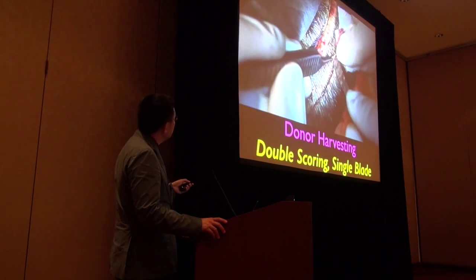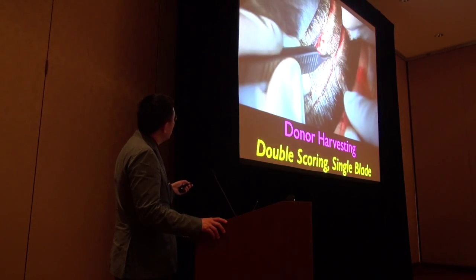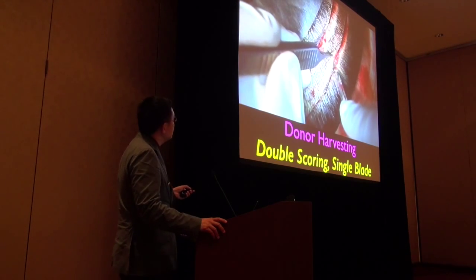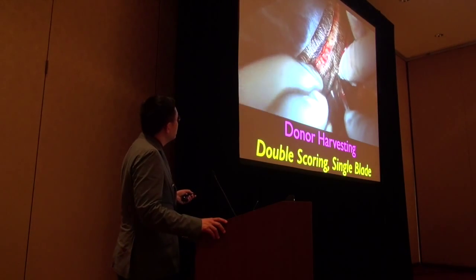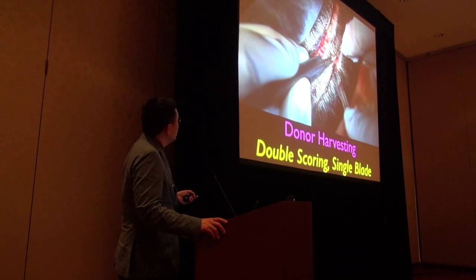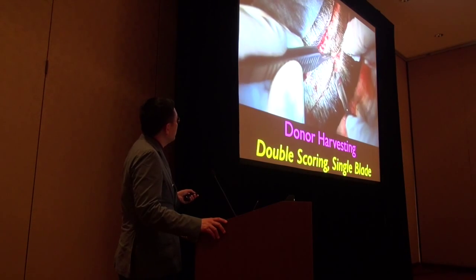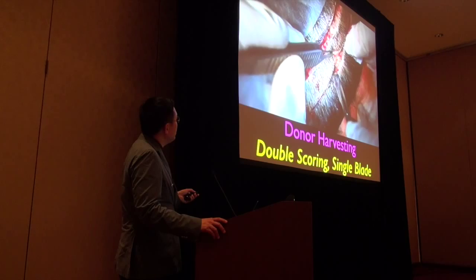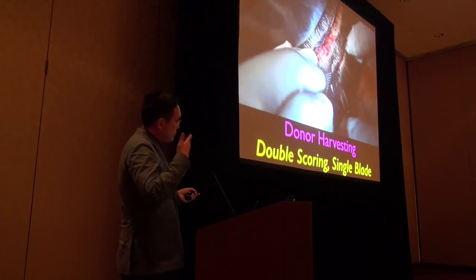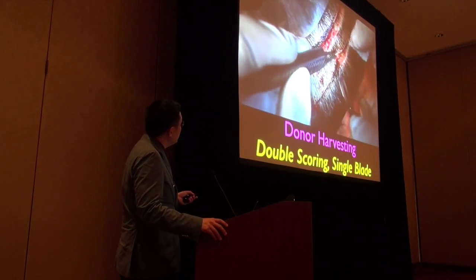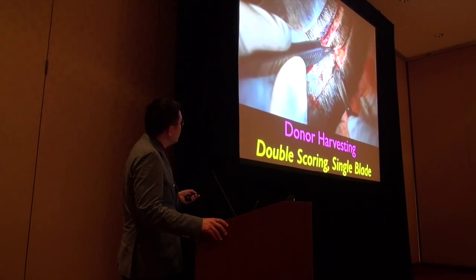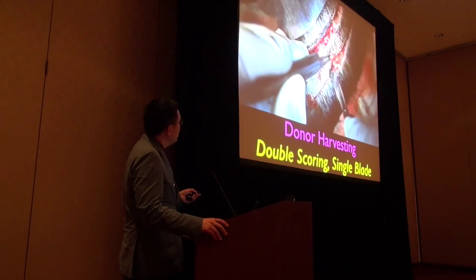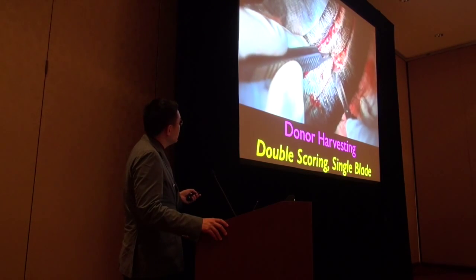I go very slowly to harvest. This is a process where I'm constantly looking for transection and making small adjustments. You don't want to rush this — a lot of people just fly through it. You want to slowly look at the depth, the angle, make adjustments, wipe for any little bleeding. You should have very minimal bleeding and minimal transection.